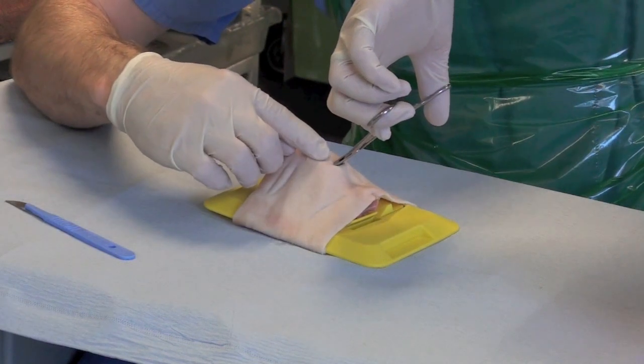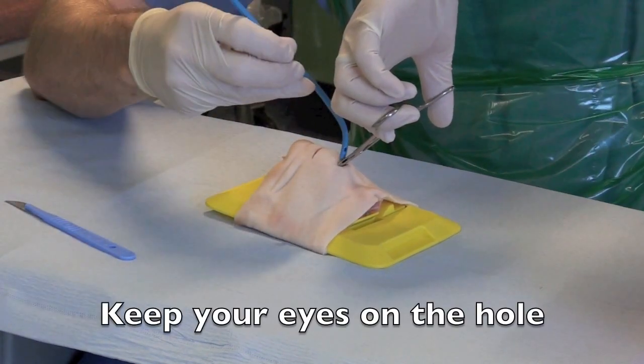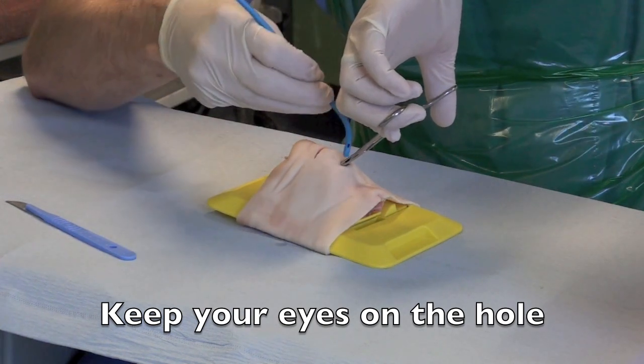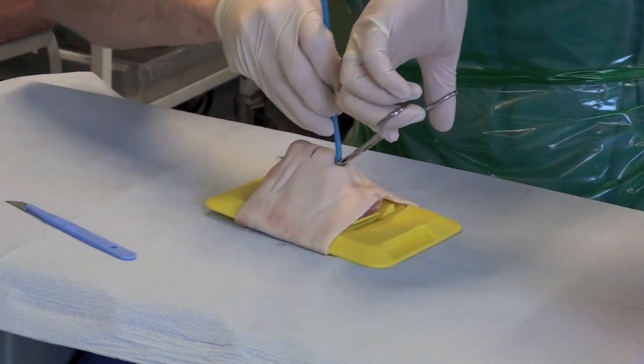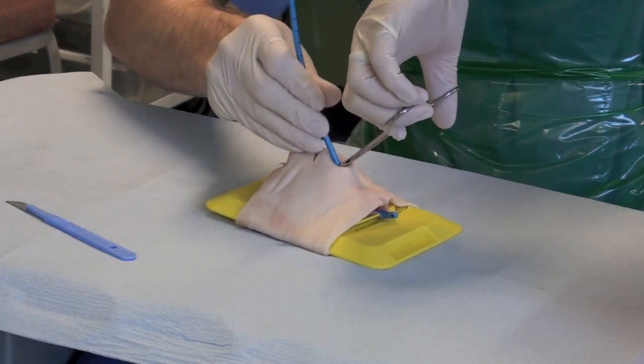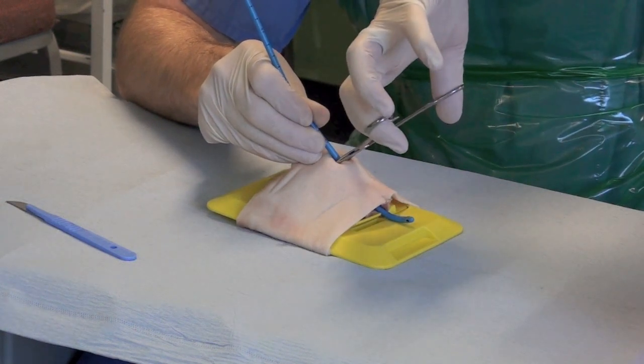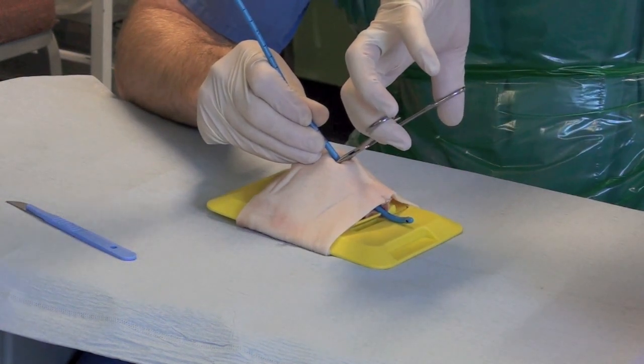Now Aishi is going to pass me the bougie so I don't have to take my eyes off of what I'm doing. I'll just pop the bougie down through the hole here, direct it southwards. Always something in the hole.